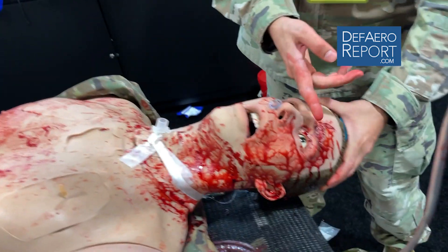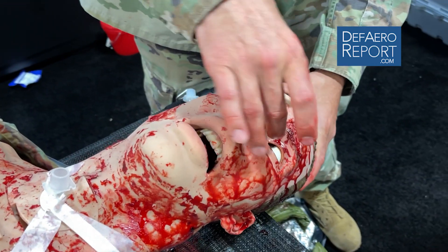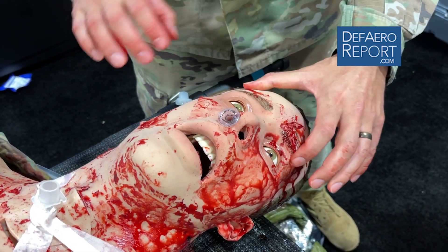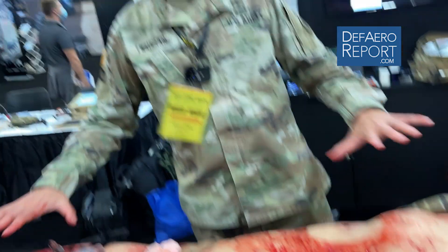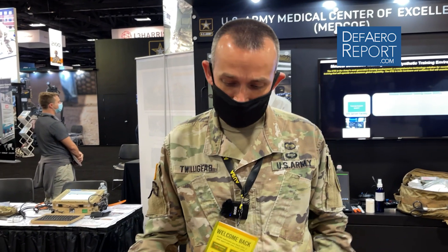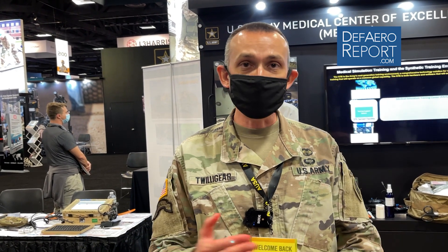Additionally, as we see the head here, we can model different kinds of head injuries depending on what the pupils are doing. Again, this is an all-soldier or CLS-level task. Once we get through the basics — the crawl phase of being able to do the appropriate medical procedures — the high point of this mannequin is injecting it into unit collective training at the platoon, at the company, at the battalion.